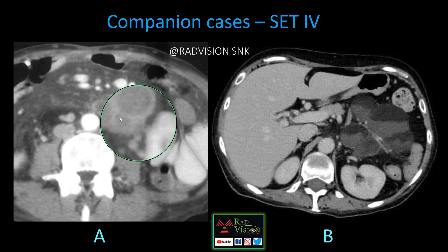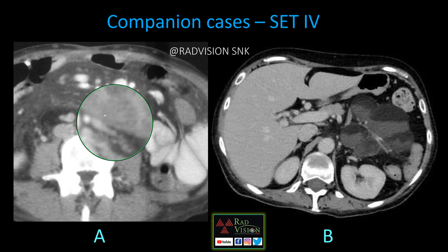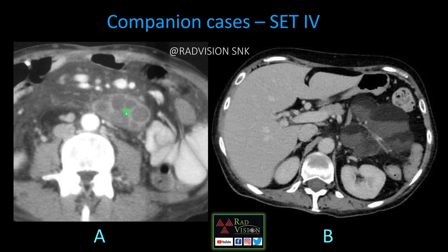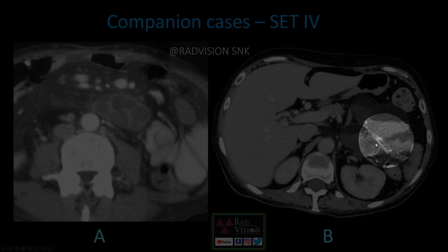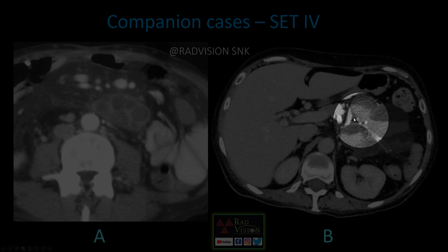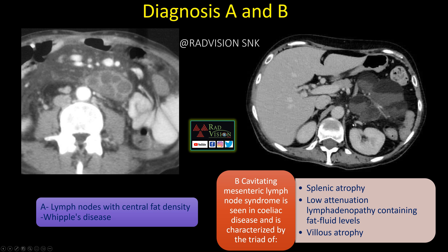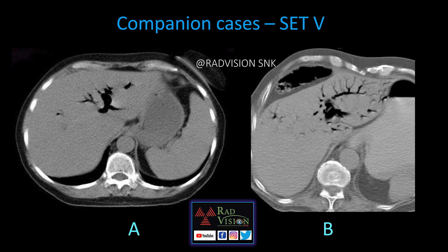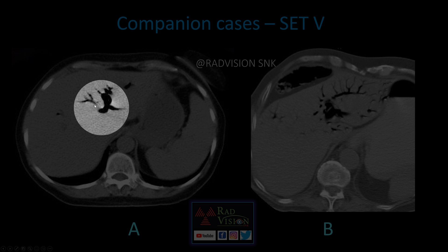Next case shows multiple conglomerate lymph nodes with central fat density — this is Whipple's disease. The second case shows multiple lymph nodes with cavitations and fat-fluid levels — this is cavitating lymph nodal syndrome seen in celiac disease. The classical triad to remember for celiac disease: splenic atrophy, low-attenuation lymphadenopathy containing fat-fluid levels, and villous atrophy.